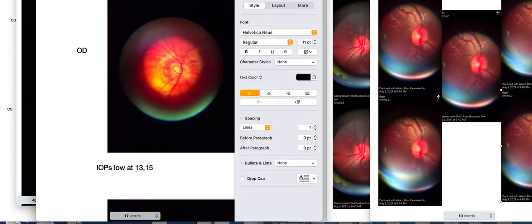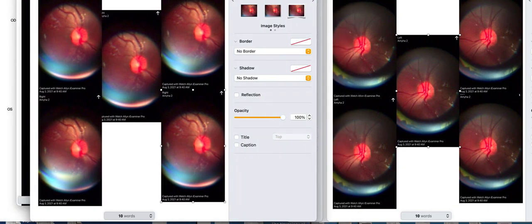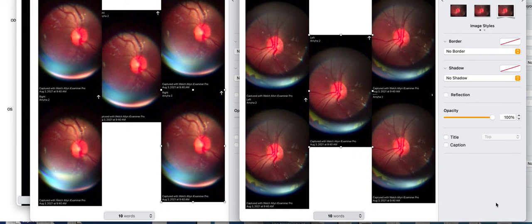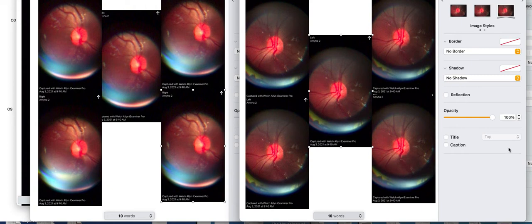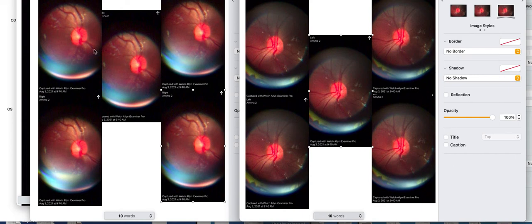Let's switch to a couple of disabled folks. These are two folks who are disabled, and it's difficult to get them to sit still, to aim their eyes. But one of the advantages of the newer Panoptic is it takes the pictures in sort of a running reel, kind of like taking a video. So you can pick and choose what pictures you want, and you can download five pictures.